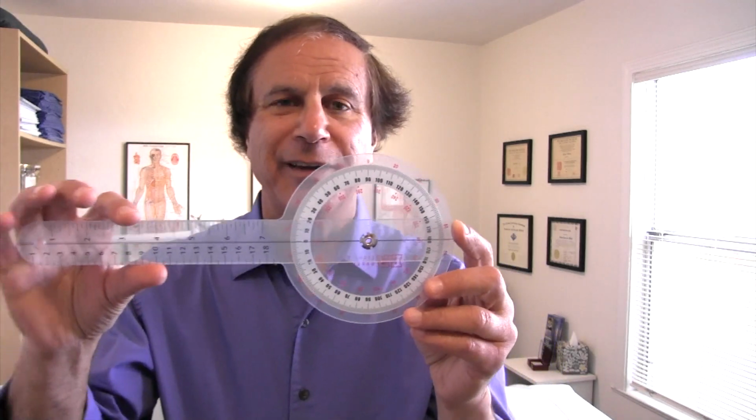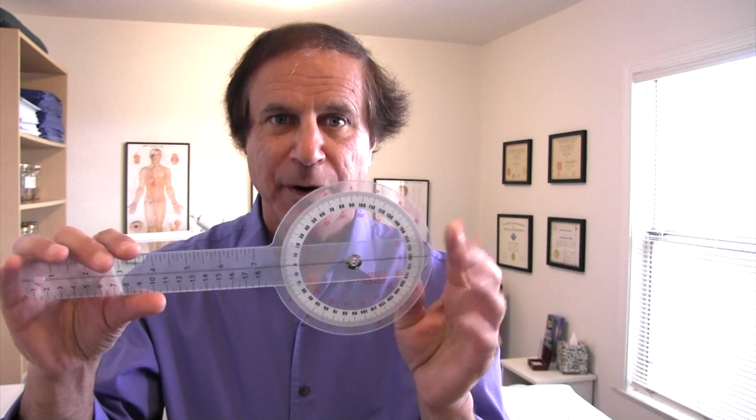And as far as your regular clients, when you accurately measure, they see your professionalism, they see the accuracy, then through subsequent sessions with them, you can compare and contrast the changes that they make. So you're measuring their progress. Now that's a whole other area of client management. I'm not going to get into that either now. How do you explain that to them, and how do you use it to measure, monitor, and manage their care for further recommendations? Anyway, let's reel it in. So I just want to show you how to use this. It's really pretty straightforward.